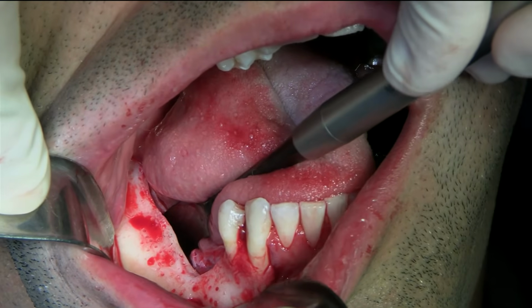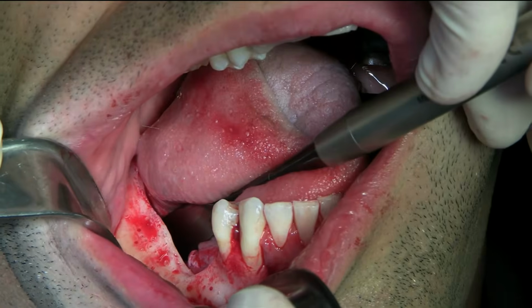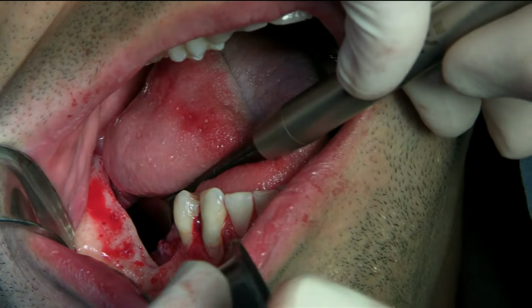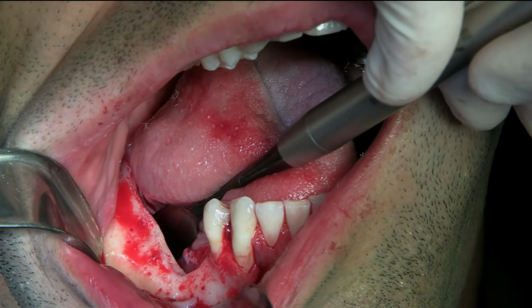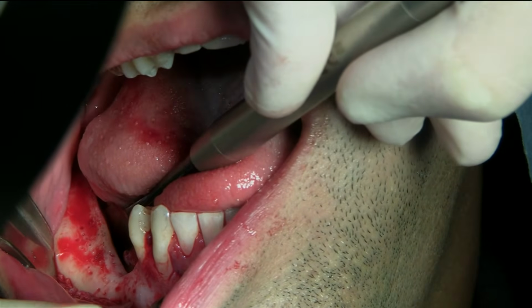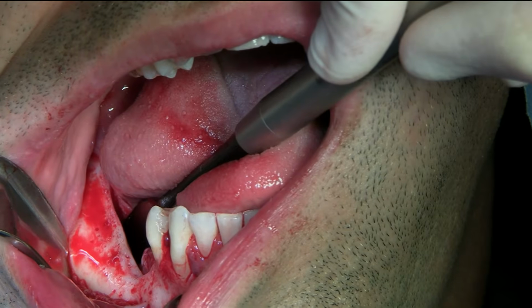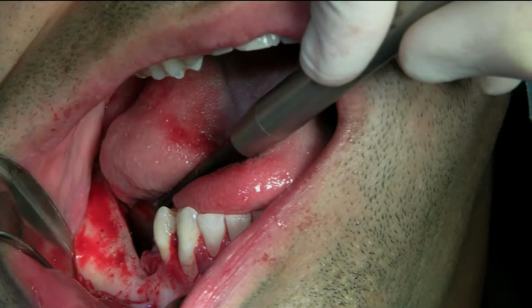Can you get in there? Just going to move a little bit to the right. Yeah, perfect. A little bit more the tooth. You can get the tooth. A little bit more to the right. Perfect.